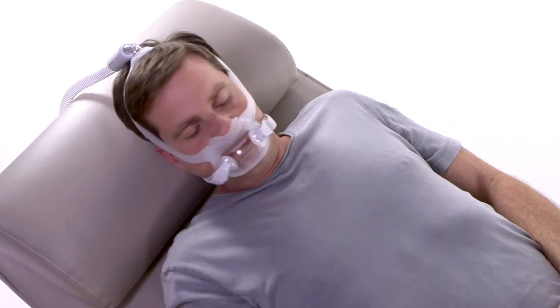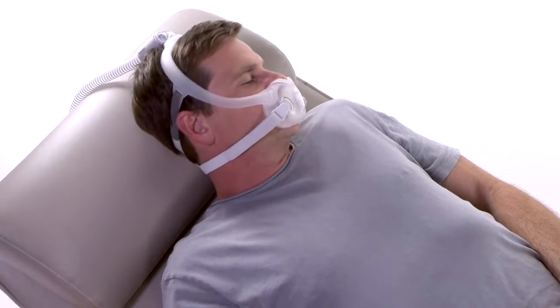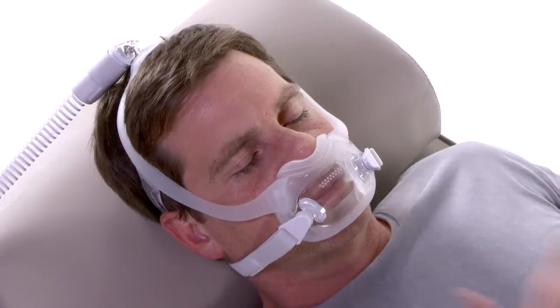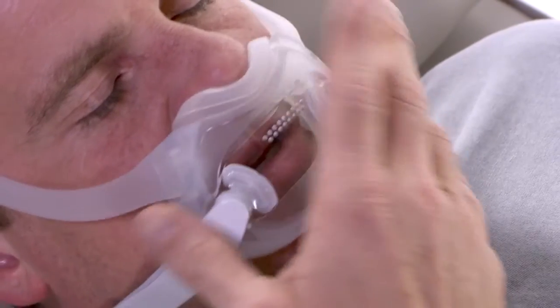It's normal to have some air leaking from your mask, but you don't want air leaking into your eyes or interfering with your ability to get a good night's rest. To correct a leak, try reseating the mask by pulling it directly away from your face and then gently setting it back into place.